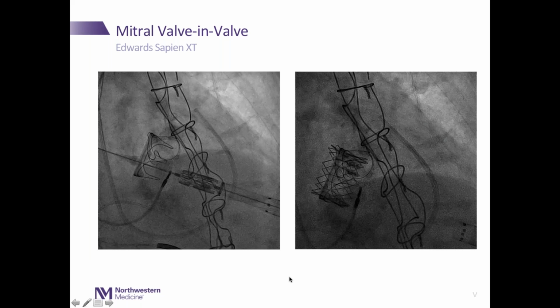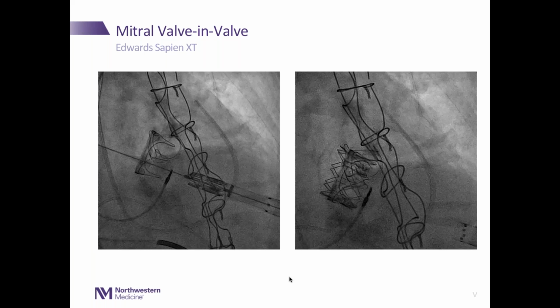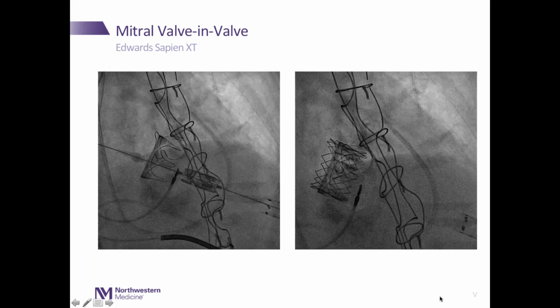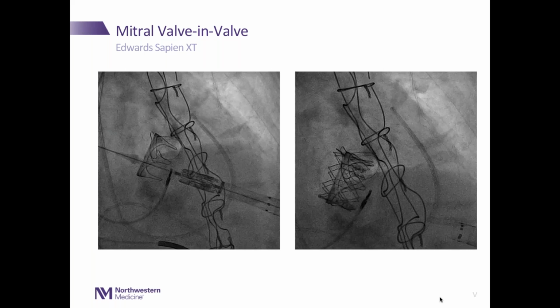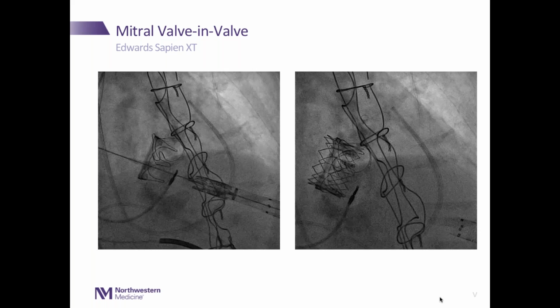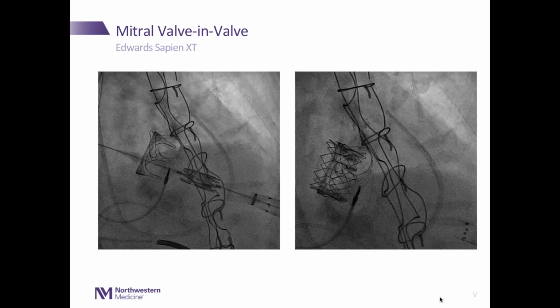What's currently under investigation is whether or not this therapy will also be good for patients who've had previous mitral valve replacement who now need a new mitral valve. This is currently being performed in select centers in an off-label approach, meaning that the FDA has not specifically approved this device for this procedure, but it's been shown to have very good outcomes in select patients. This is a good segue to the next segment of the talk.